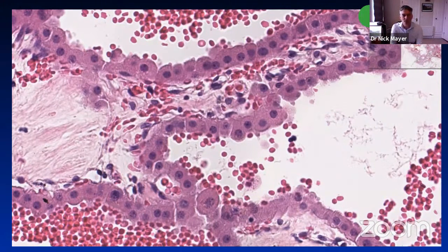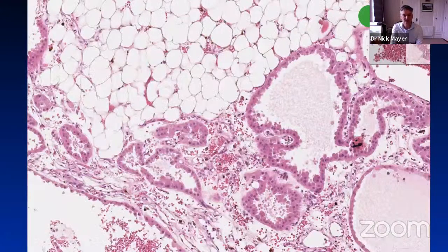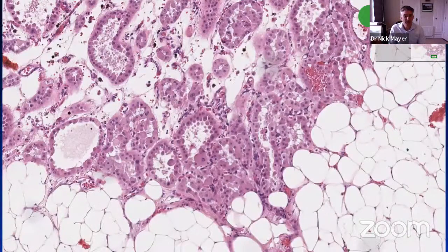It wasn't difficult to spot this feature because it was very prominent in this tumour. There was a lot of infiltration of fat, and I've got 2 pictures of that to emphasise the fact that there's quite a lot of it. But again, a similar cytomorphology to that already described.